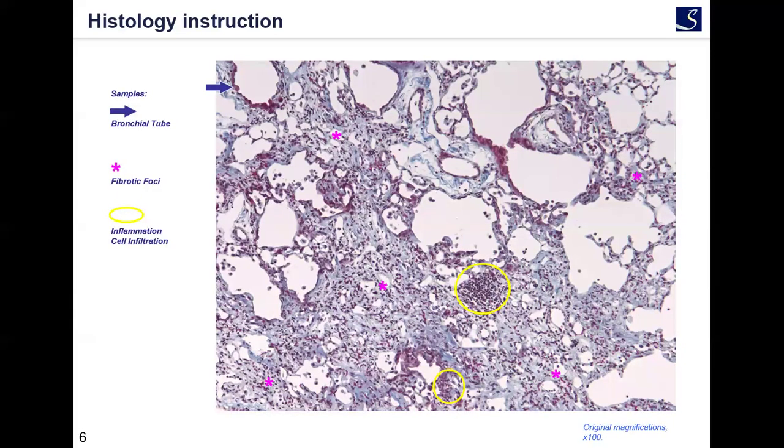Ashcroft score is graded using Masson's trichrome staining. Collagen is stained blue, nuclei is stained dark red to purple, and muscle tissues are stained red to pink. Blue arrow shows bronchial tube. Pink asterisks are examples of fibrotic foci. Yellow circles are inflammation cell infiltrations.